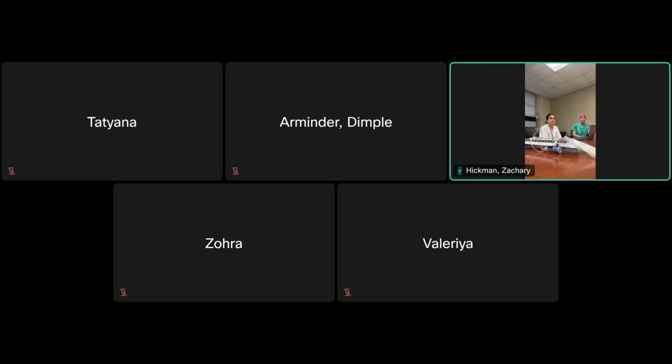The other time we'll do it often is if you've got navigation in the OR for a posterior fossa tumor or something like that, and then it's just nicer because you can have the patient positioned prone for your case and just do the EVD at the same time after you're prepped and draped, rather than having to do it first and flipping the patient. But if you're going to be doing an occipital one, it's nice to have navigation because it's much easier to miss than a regular EVD usually. We do it for shunts, so obviously a lot.